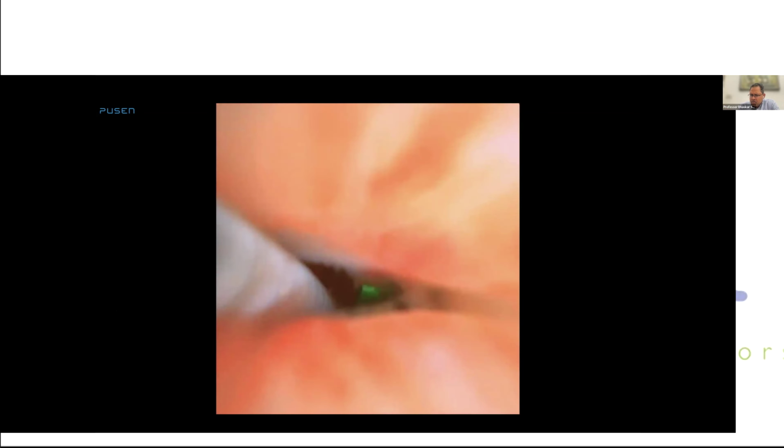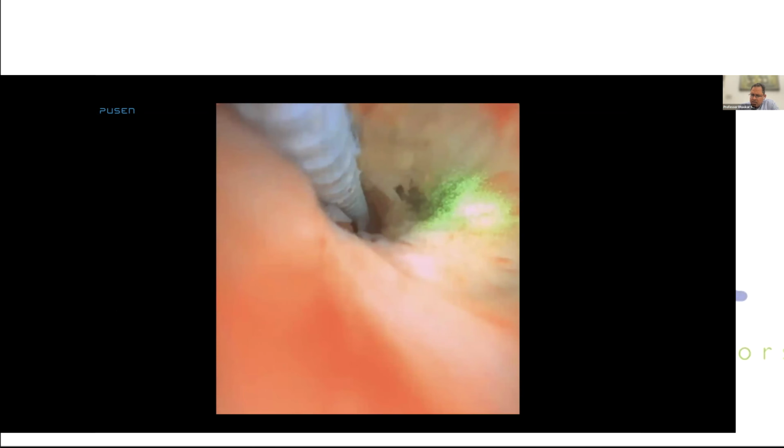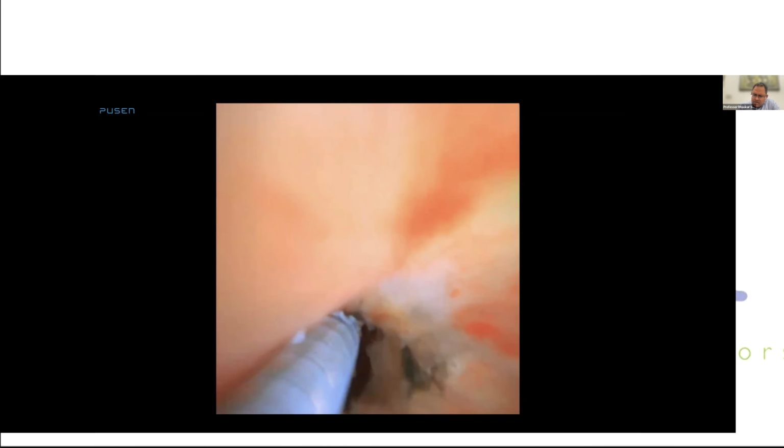So here I am trying to do a limited endopyelotomy, 1 joule, 5 to 10 hertz, to open it enough so I can get the scope in. Once the scope goes in, so this is the second video. As the scope goes in, you can see there's a lot of dust and debris because it's a very dilated system. So rather than having to syringe it out, bit by bit, which takes a little bit longer, more effort, you can use suction to just continuously suck and get the stone closer to you.